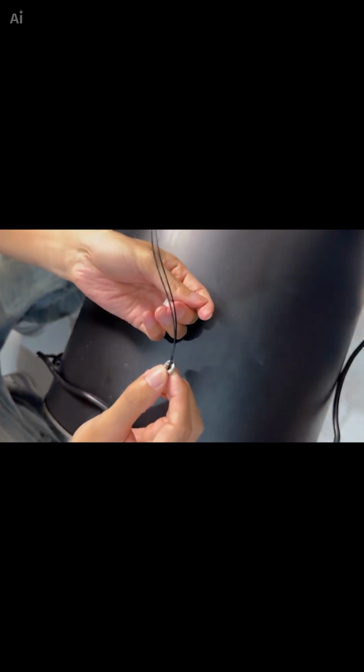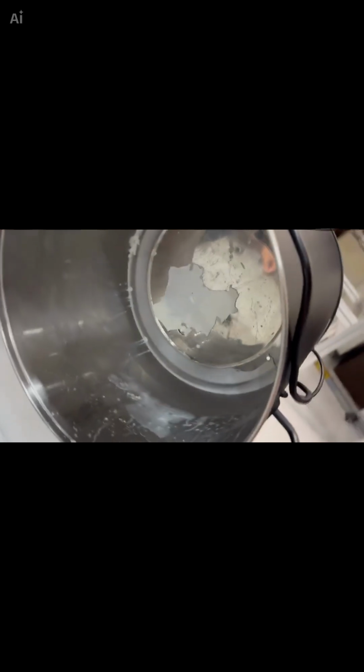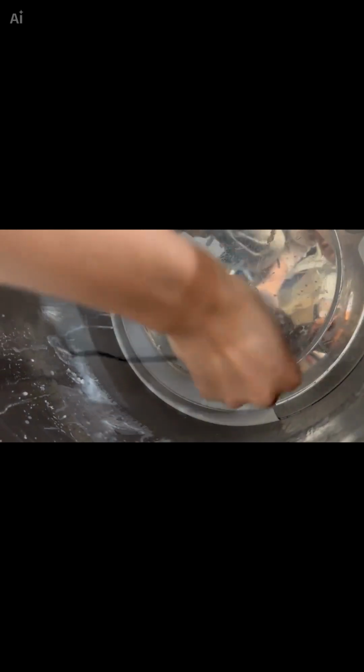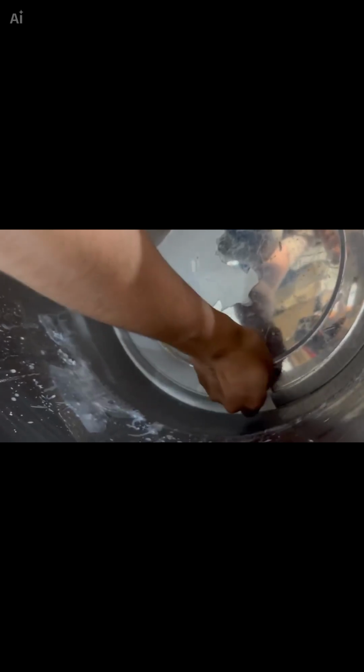Remove the previous temperature probe, the one that was just cut off, and set it aside as it's no longer needed. Then in this step, you need to separately remove this nut, then take it to the temperature probe, and from inside the tube, on this side of the cylinder, the temperature probe hole is here. Then pass it through like this.